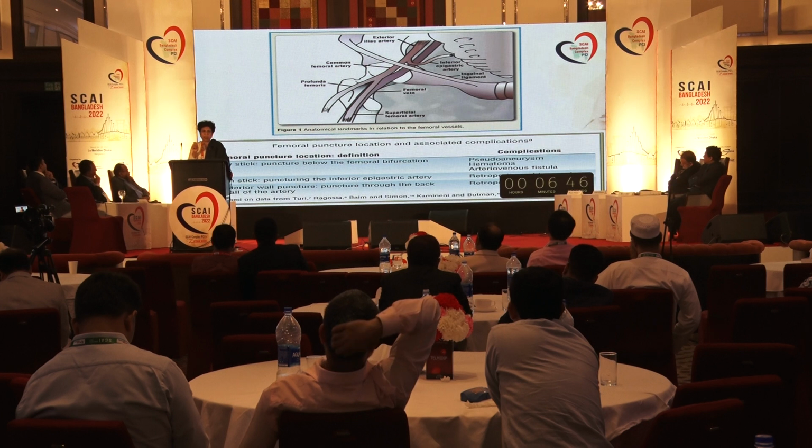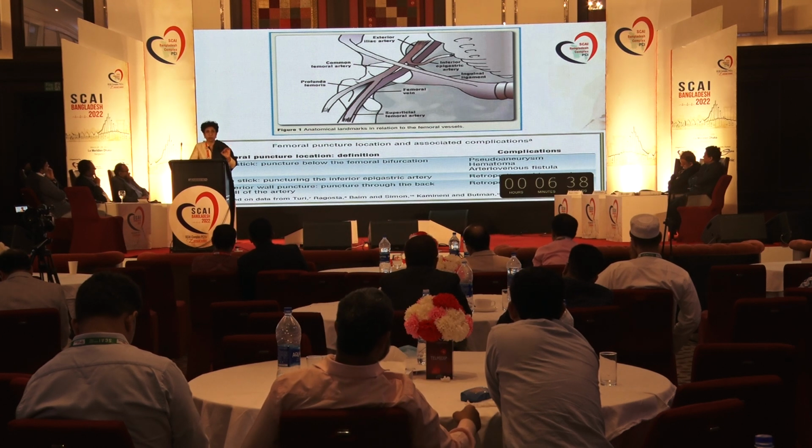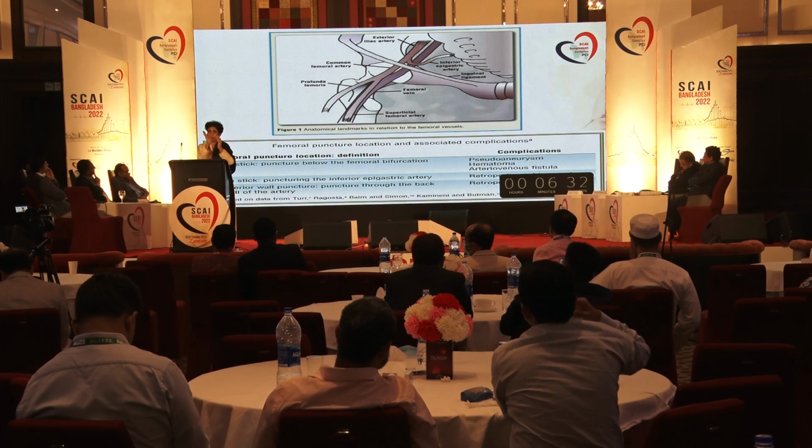So femoral puncture should be precisely at the site where the common femoral artery is. We cannot go above it, we should not go below it. And usually it is in the head of the femur, just in the middle part.